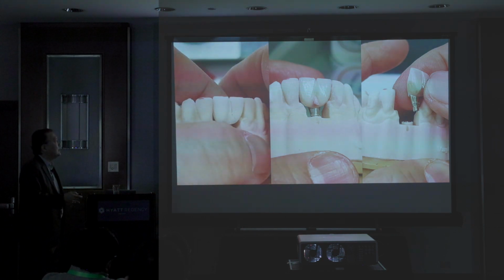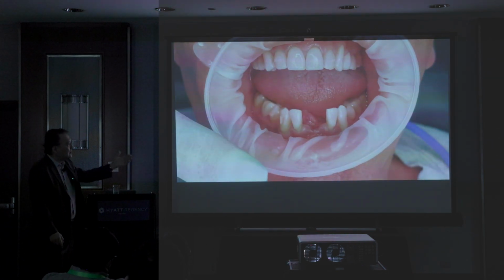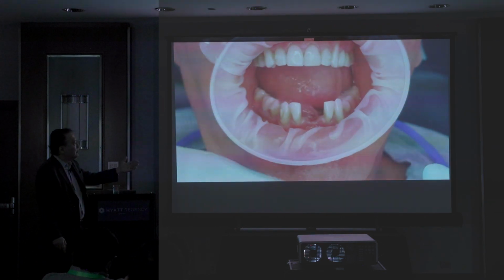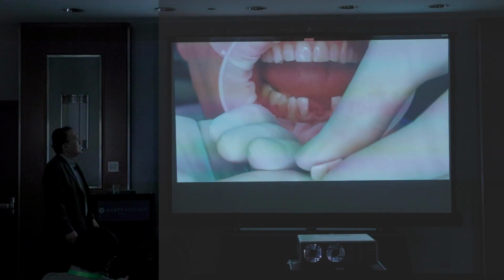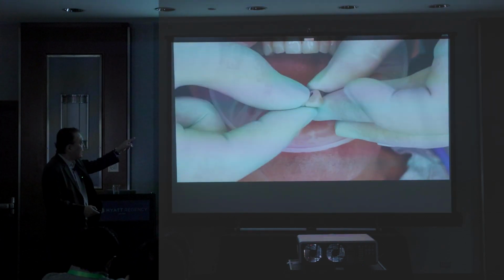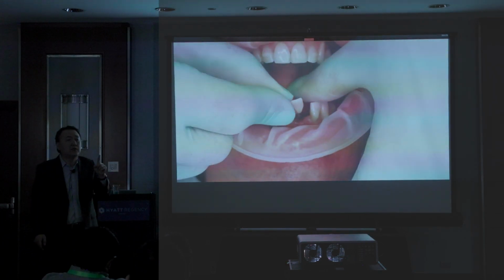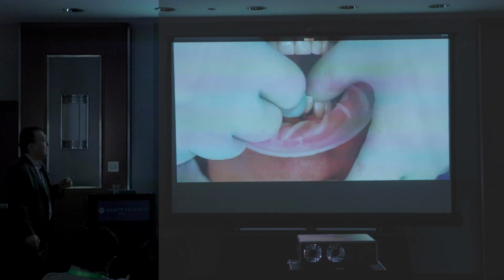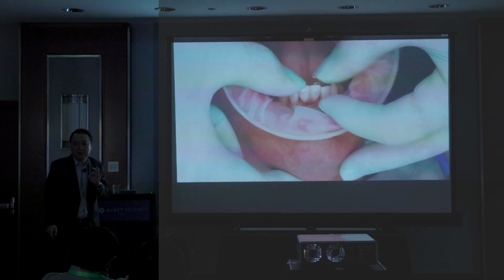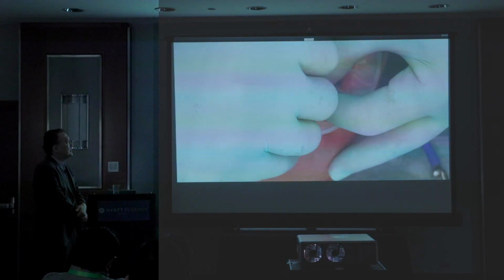Anyway, contouring, finishing it, second time. And then the doctor sent me, same guy, John Vargas from New York, and he shared about the placed implant. So what I approach for the Jason teeth is, it has a lot of enamel. It doesn't look like Vita color, it doesn't look like A1, B1, you cannot find it. So we have to utilize more dentin with a little enamel overlay, and then we can match it up, just like that.